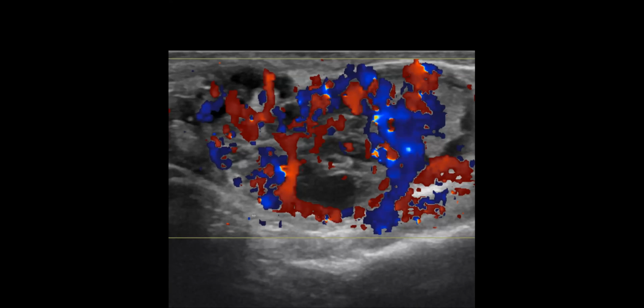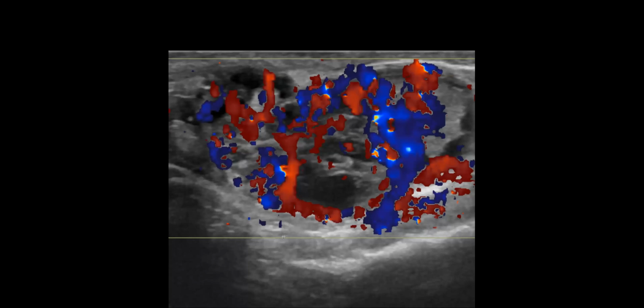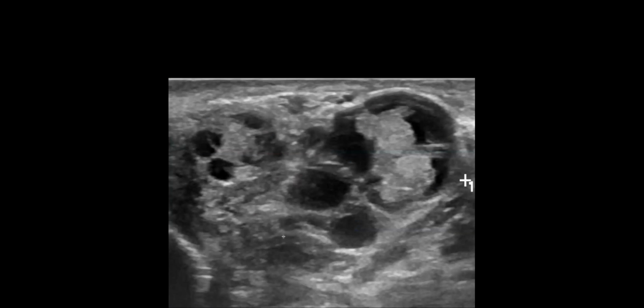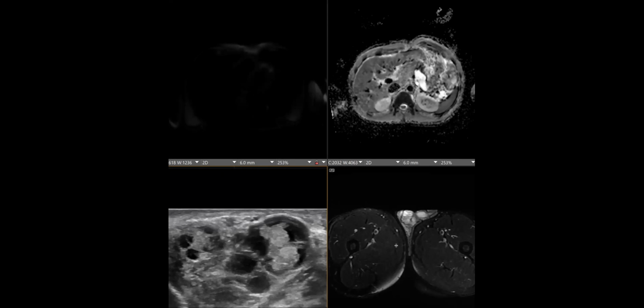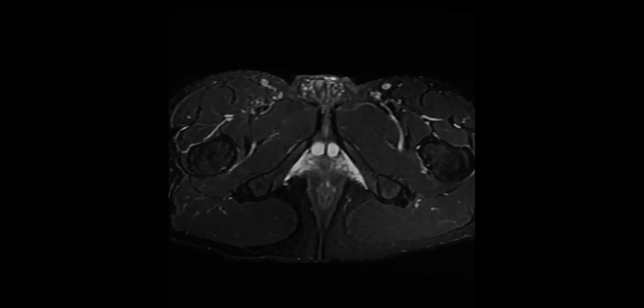This is similar to Jonathan's case, a series of findings that lead up to a common diagnosis. So this is a scrotal ultrasound. We have this cystic, solid extratesticular lesion. I'm going to be careful not to scroll too much on the ultrasound images so that I don't expose any unnecessary PHI. The patient had a prior left orchiectomy, and this was the MR correlate to that solid cystic extratesticular lesion.